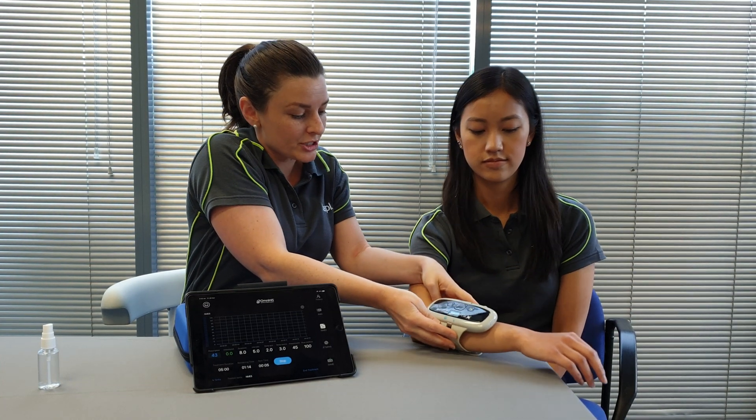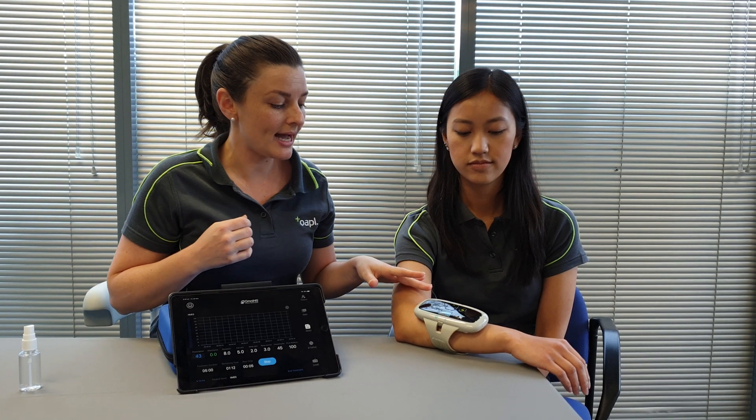Anita, if you're able to just rest your arm there and really relax. The device is linked to the iPad via Bluetooth and we've already preset a prescription or parameter mode for Anita.